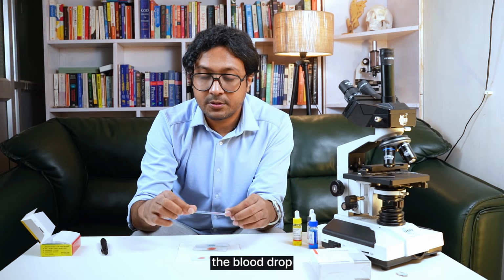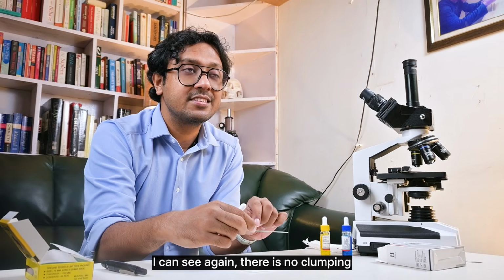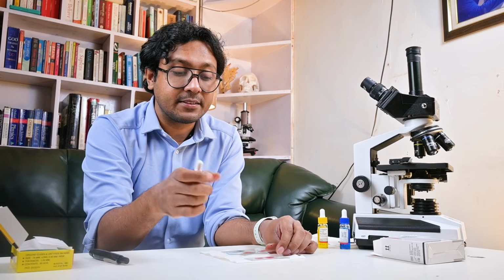The blood drop where I have put anti-Rh, there I can see again there is no clumping.